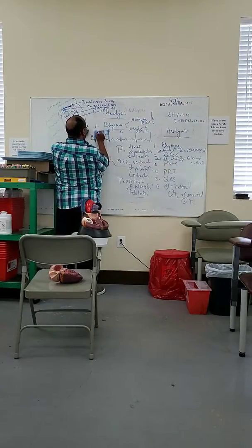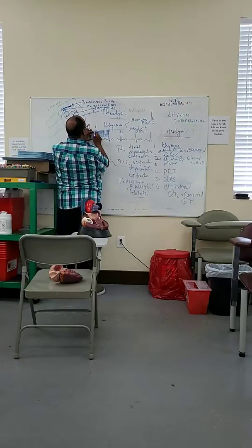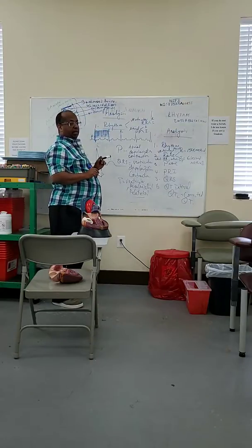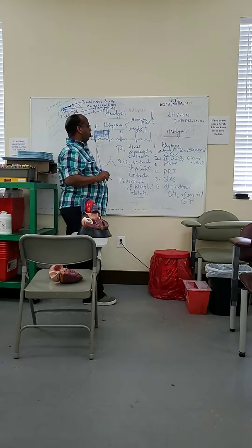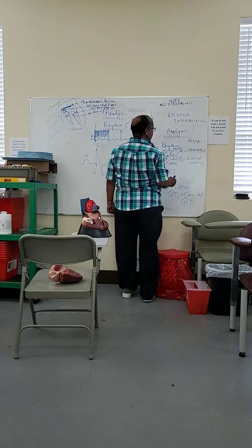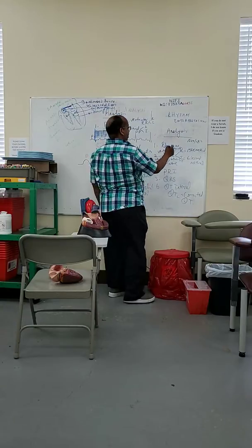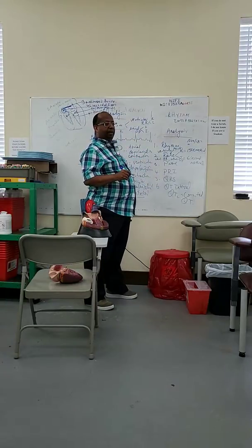So 5 by 5 will be how many boxes? 1 big box. Okay, so the 5 little boxes will be 1 big box. Then another 5, another 5. Okay. So now how many do we have? 18. Yes. So what do we do? We divide 1500 by 18. We have a nice calculator. Do that for me. So it will be how much? 1500 divided by 18.